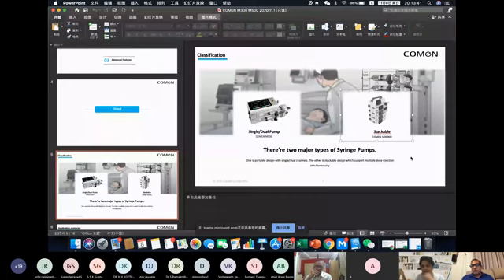So how many pumps can get into a single station, a single central? The maximum number of pumps to connect to the central is 128. What's the maximum in a dock? Stackable, one stack, up to 4. We said 2, 4, 6, 8. That is up to 4 numbers. 4, 6, 8. Okay.